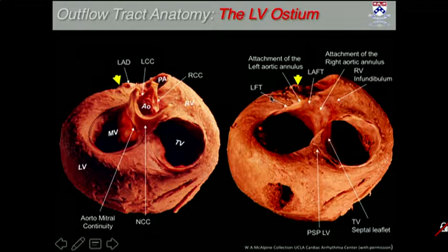The rhythm that we're talking about doesn't come from the endocardium, the ventricle, but from this area that comes down from the epicardium, the lateral medial area, because this is not totally lateral, it's lateral medial of this region here, and hence the earlier activation is in the duodecapolar catheter, because it is here in the vein, and we are activating this epicardial area here. There's no use going to the epicardium here, because this would be full of fat, which is around the circumflex. So that is the application.